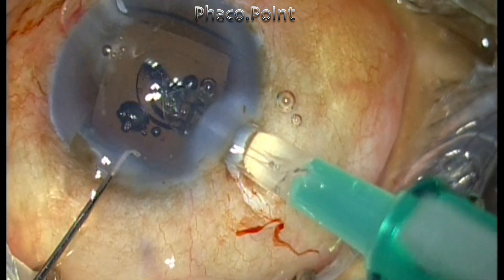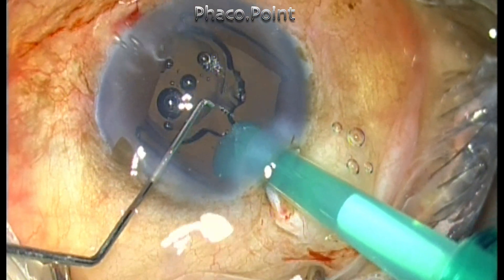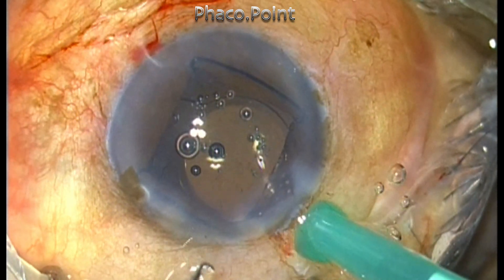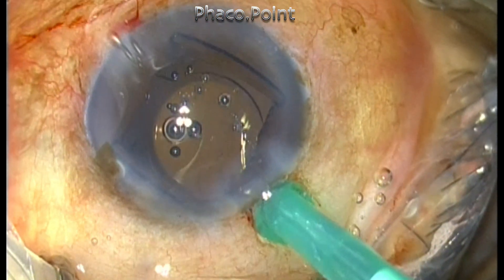While injecting the intraocular lens, I had my second setback. The OT nurse had loaded the lens improperly and the trailing haptic got stuck in the plunger. Trying to extricate it, I actually ended up breaking the trailing haptic completely.